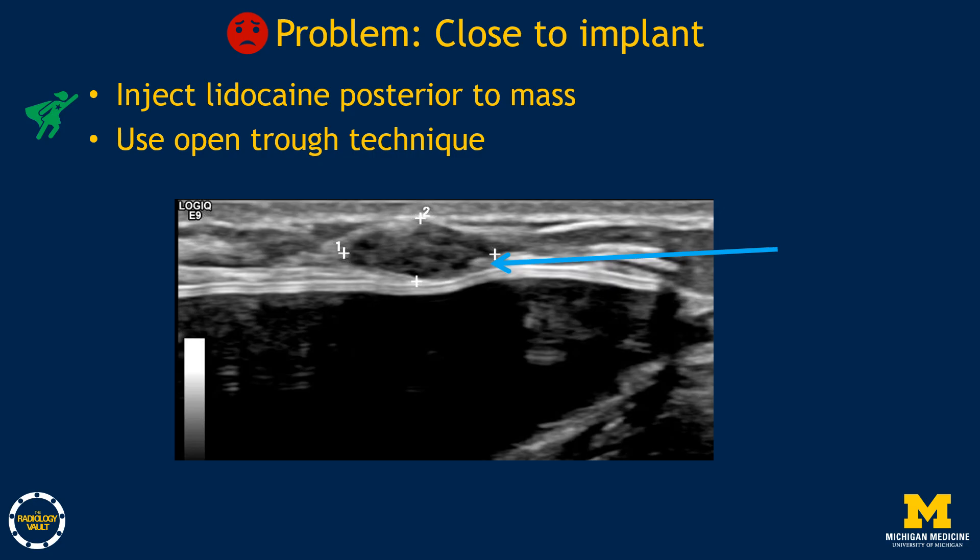If a mass is close to an implant, it's best to approach as parallel to the implant as possible. You can inject lidocaine between the target and the implant to lift the mass off the implant, then — working quickly before the lidocaine dissipates — use an open trough technique to guide the trough underneath the mass. These cases are very tricky, so don't attempt them as your very first biopsies.